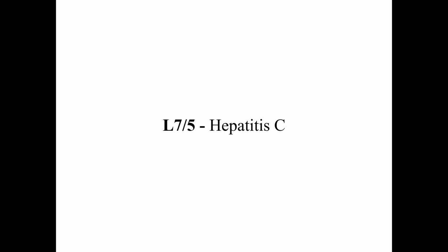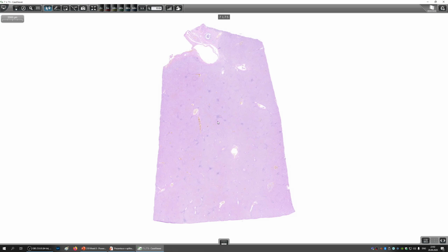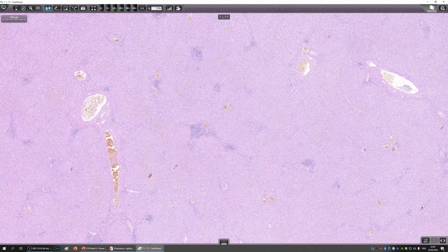But hepatitis B is also very similar to this picture. They are quite similar to each other, so you distinguish them clinically by performing a serology for hepatitis B antigens. And you can perform PCR to detect the copy number of hepatitis B and hepatitis C viruses. So let's check out this case. This is going to be an autopsy case of, I think it was a younger gentleman who had a drug habit, an intravenous drug habit, and he died of hepatitis.